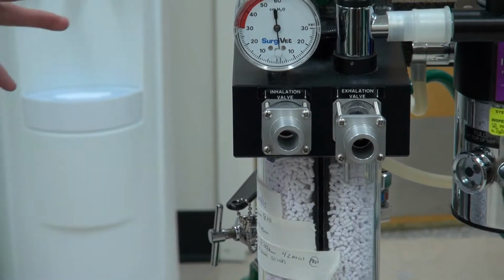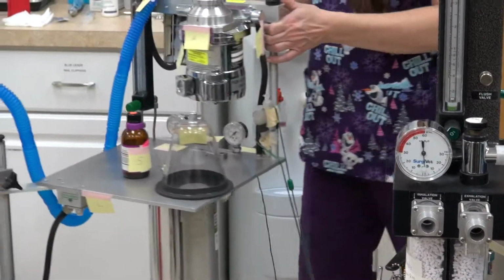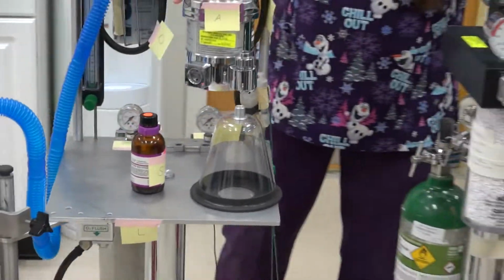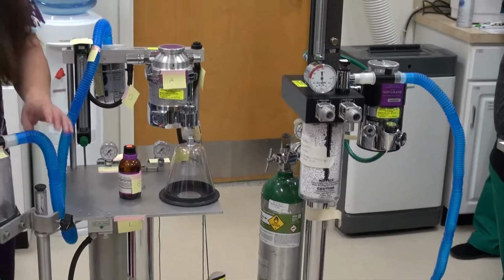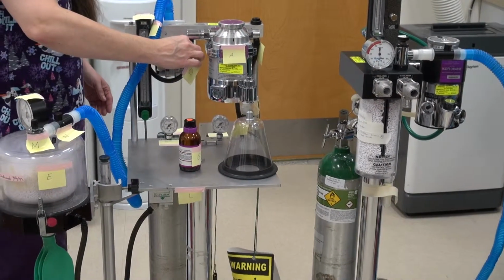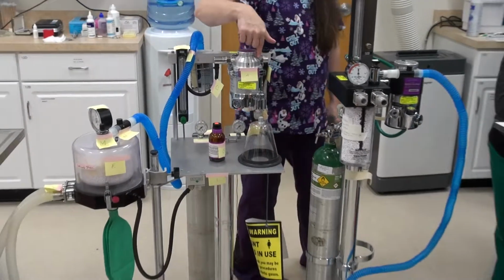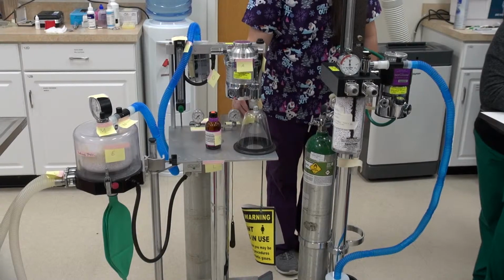We're going to make sure all our gas lines are correctly connected. When they're talking about gas lines, we're talking about what? We're making sure all of these tubing lines right here to our O2 flush, our oxygen going to our vaporizer, and then our mixture going out to our patient. Everything's hooked correctly, okay?